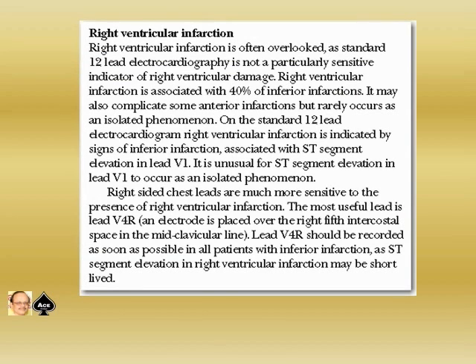Now the right ventricular infarction needs some attention. Right ventricular infarction is often overlooked as the standard 12-lead ECG is not a particularly sensitive indicator of right ventricular damage. Right ventricular infarction is associated with 40% of inferior infarction. It may also complicate some anterior infarction, but rarely occurs as an isolated phenomenon.